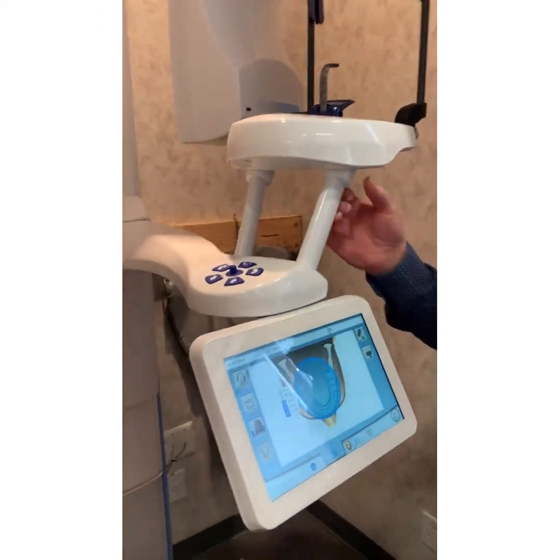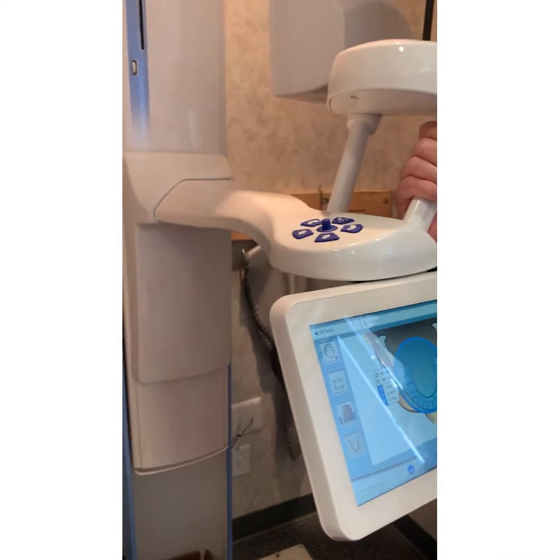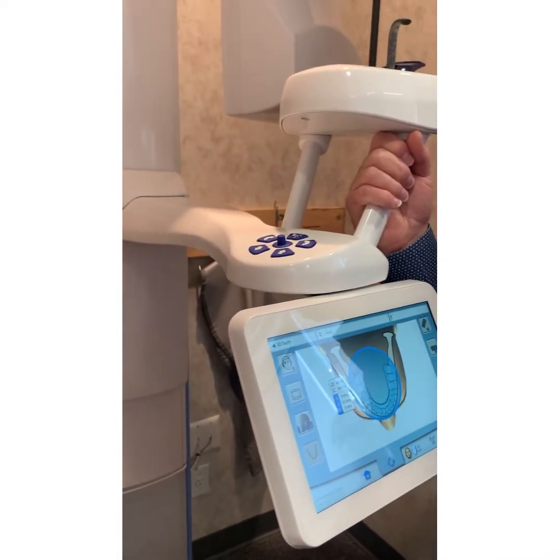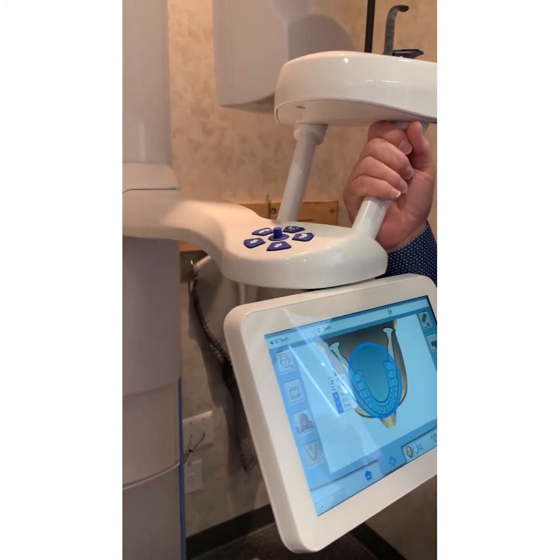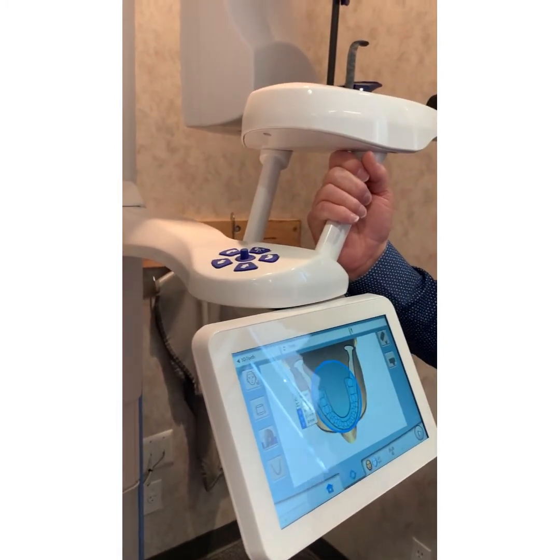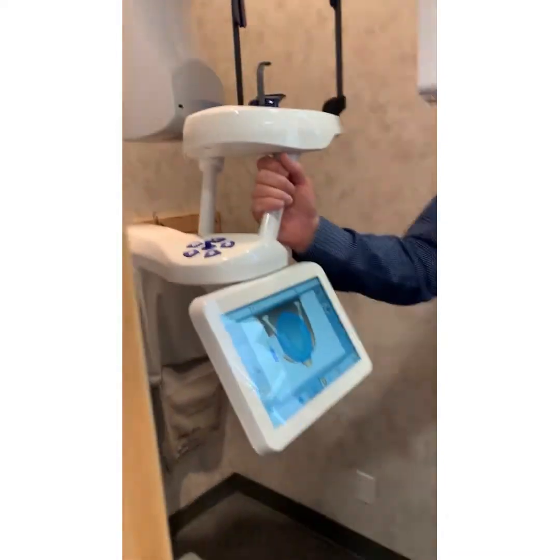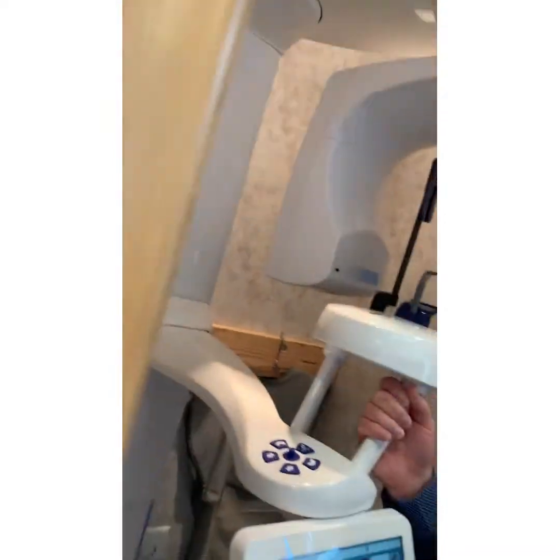Can I ask you a quick question? Yeah. In Massachusetts, a place I've worked installed a cone beam. It wasn't a high-end one, but they said that if you take a full mouth, you have to send it to something to have it evaluated for pathology, because you're now medically responsible. The dentist is medically responsible for cancer or tumors or whatever. Because you saw it? Or because you had a diagnostic image of it? That now you're in charge of their cancer.